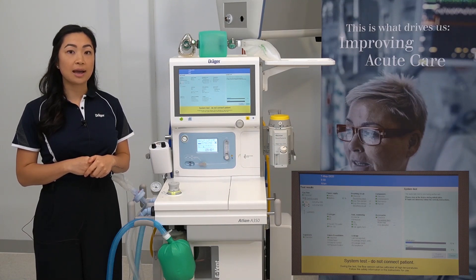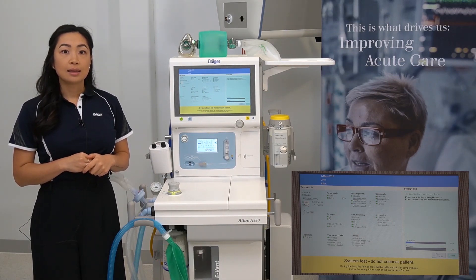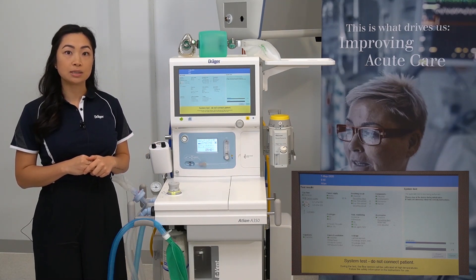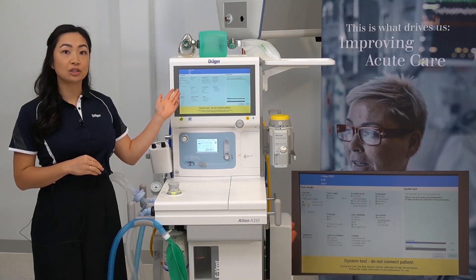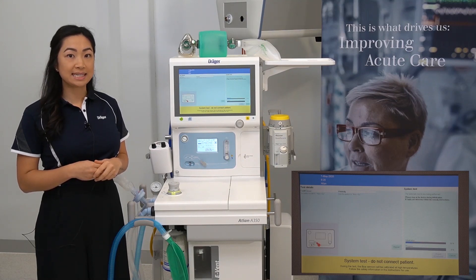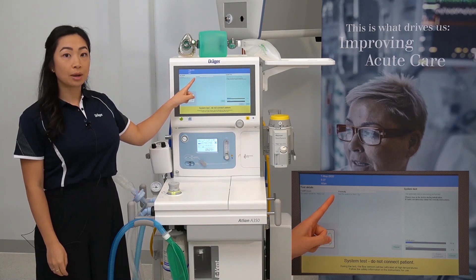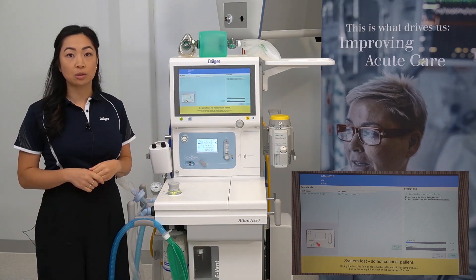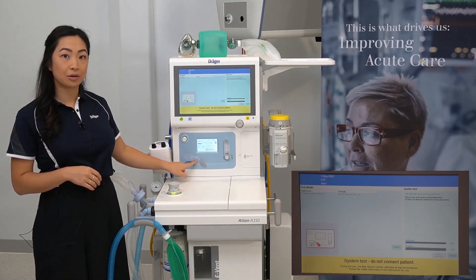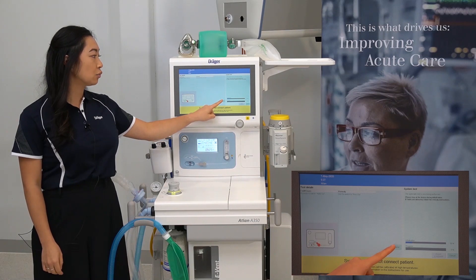Then press the tick to start the initialisation for the system test. Please remain with the device during the 60-second initialisation, because if there are any faults or issues detected, the initialisation will pause. This will allow you to remedy and troubleshoot the issue and then continue the initialisation. When a fault has been detected, the device will indicate the possible fault, the possible remedy, and a highlighted image to help you troubleshoot. In this case, the oxygen switch has been left on ADO2 — set the switch back to auxiliary oxygen and then press repeat to resume the initialisation.